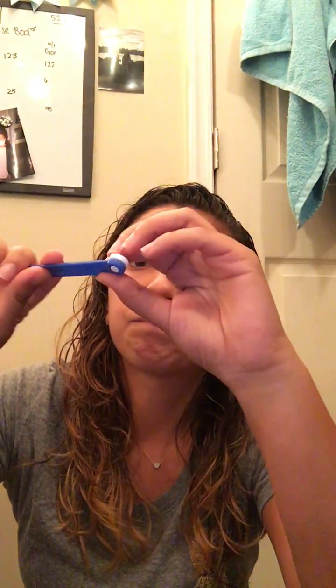I know this is kind of long and I'm rambling a little bit, but I thought I'd just get it done. So another one is expanding. When you do get your expander, you'll get a key, which is basically just like a little metal stick to expand it. I don't have to expand mine today, but I will kind of talk you through it.